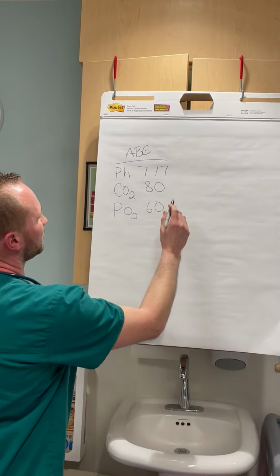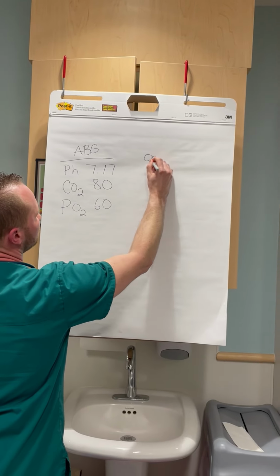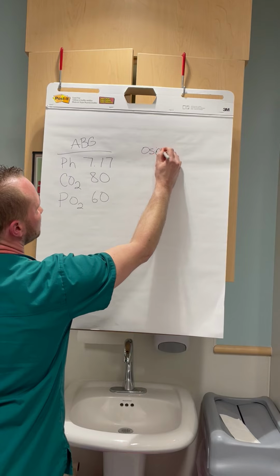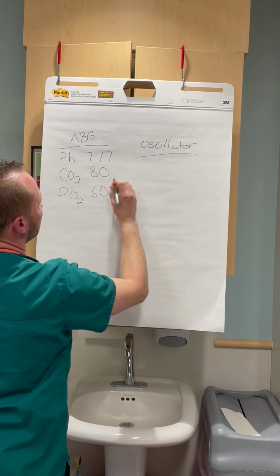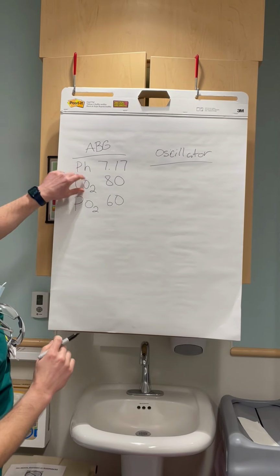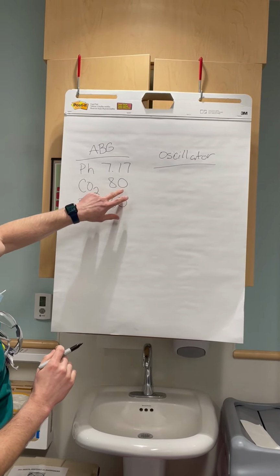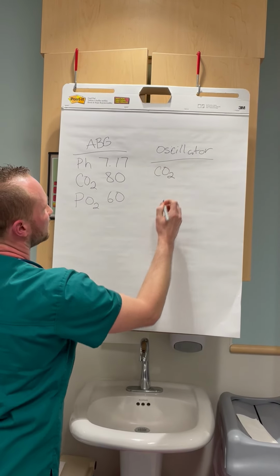So what we're going to do here, the oscillator itself, like I had said in the prior videos, this is all a CO2 issue, all right?